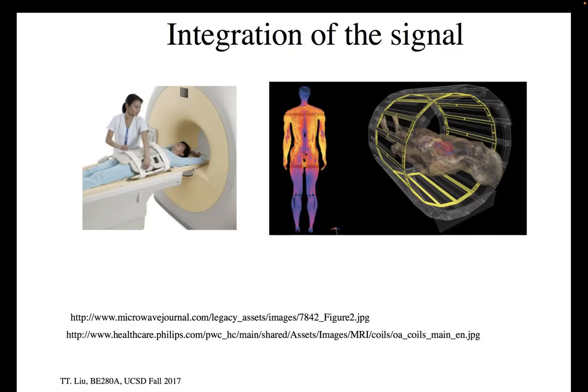and creates a magnetic field inside the patient that in fact rotates. So you can think of a radio frequency field also as a magnetic field. If I have a vector here with its arrow tip pointing up, caused by current density running through these wires.